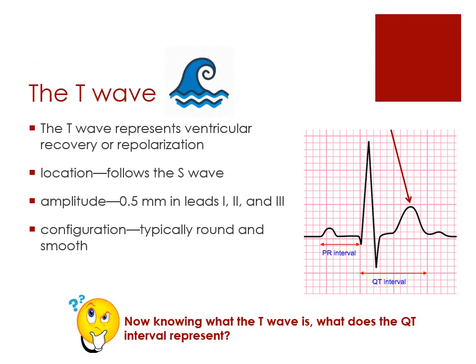Now, the ventricles are going to relax, and remember, because the ventricles are a bigger muscle, that T wave will look a little higher in that bump than the P wave does. And that's just when the ventricles relax. Because the ventricles are relaxing, you're going to actually see that relaxation or that repolarization happen, and that's what that next bump is, that little higher bump on there.